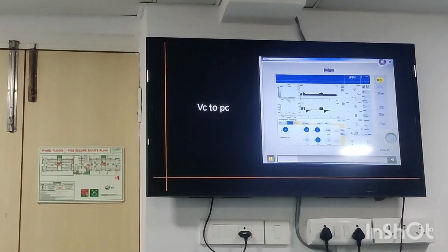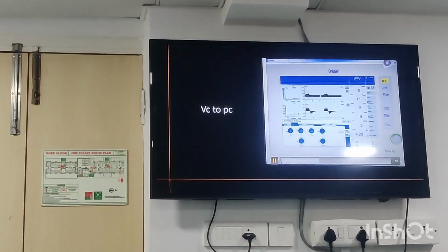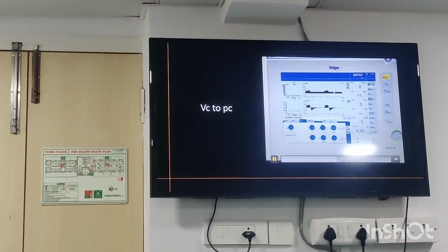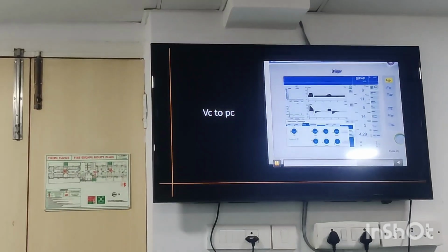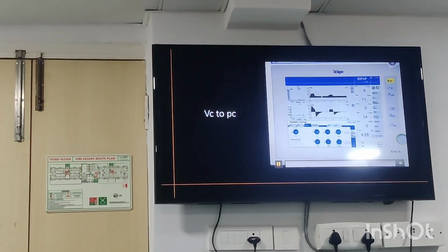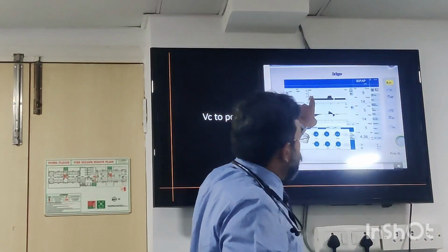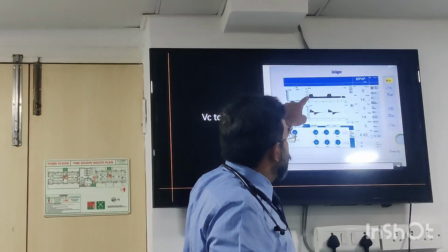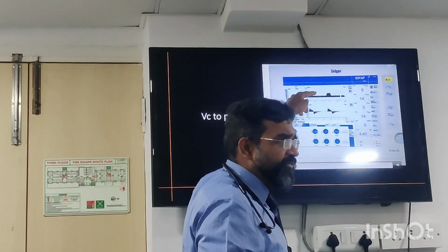So this is volume control. Okay. Pressure control. What is exactly happening in the graph? Tell me the difference in both the graphs. Okay. What has happened? When it reaches a certain point, what is happening here? It has reached, the control has changed. The limit was initially varying, right? The limit has changed. So it has become a pressure controlled graph.